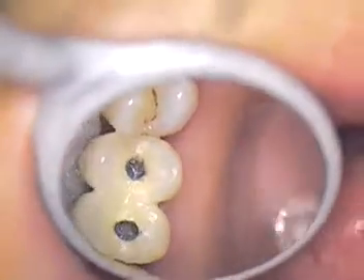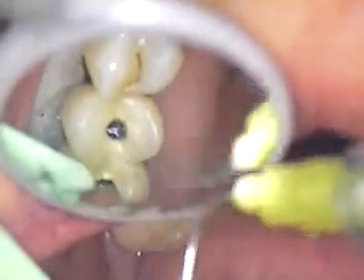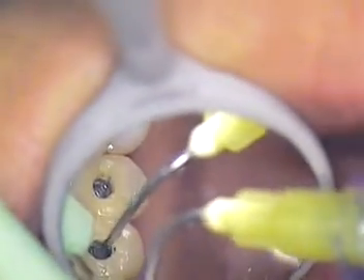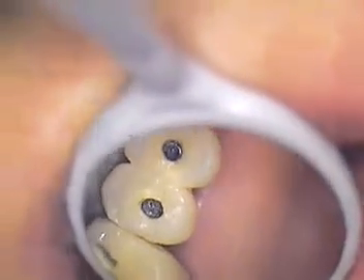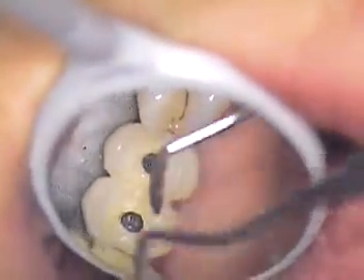I'm going to just dry this off. I'm going to add a little bit of water — I'll suction that. Should be okay. Perfect. We can certainly change that out since we've got some debris in it. That'll be our third, I think.